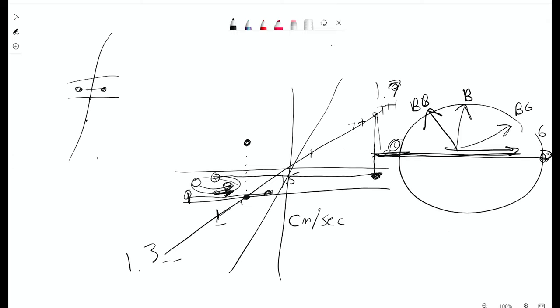Well, what can you do about that? You're going to take your Venc to 500 centimeters per second, because if you have an accurate Venc, that's the only way you can actually quantify how fast that flow is. Measure that flow, right?